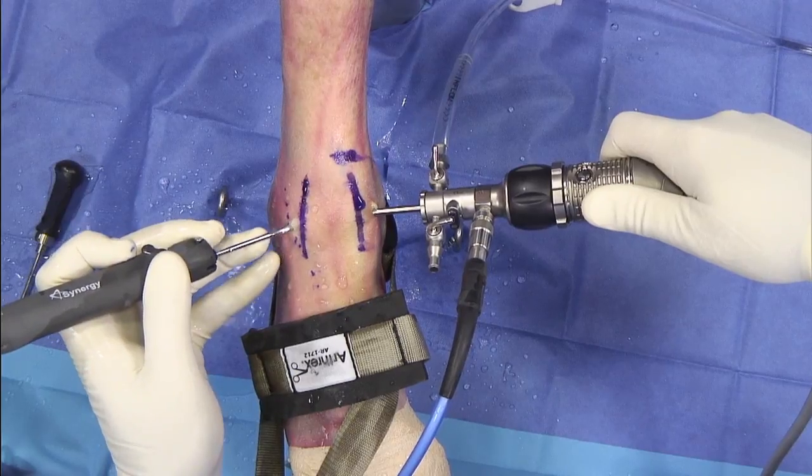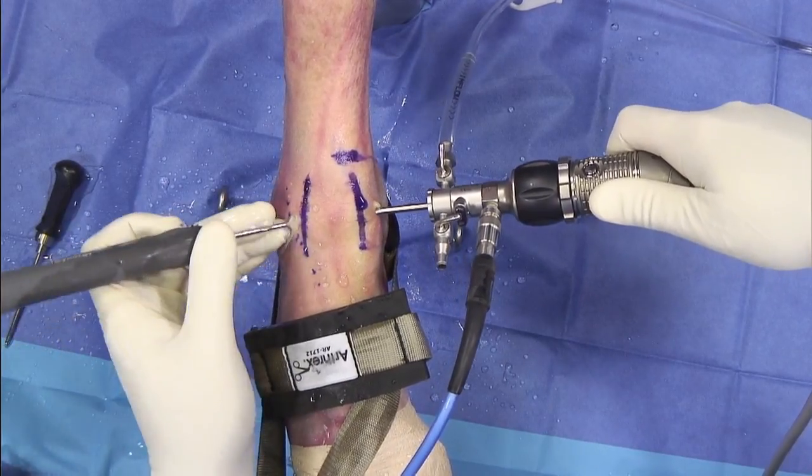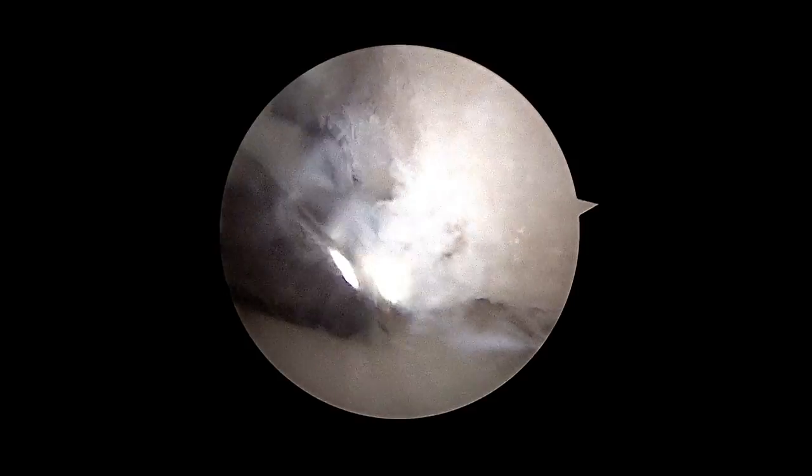The Arthrex Distal Extremity HD camera head has helped me treat my patients better. It has a lightweight ergonomic handpiece, has high-quality images, and allows me to see all the pathology I need to see in all distal extremity arthroscopy.